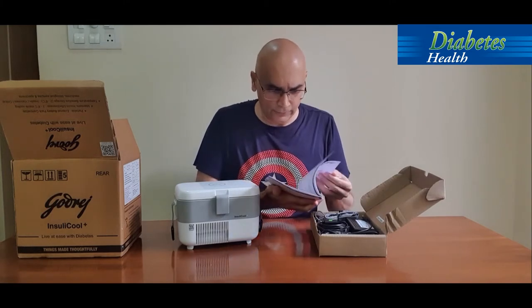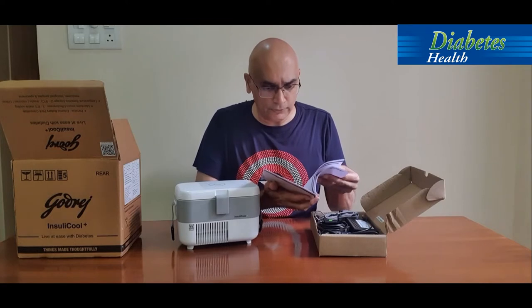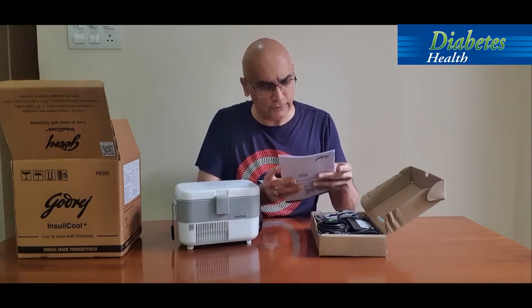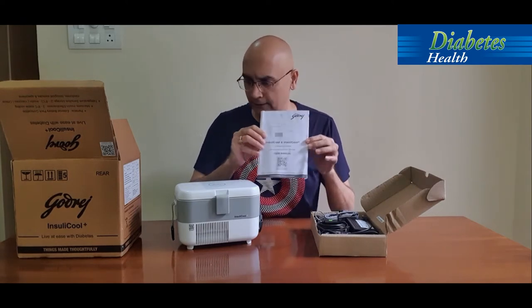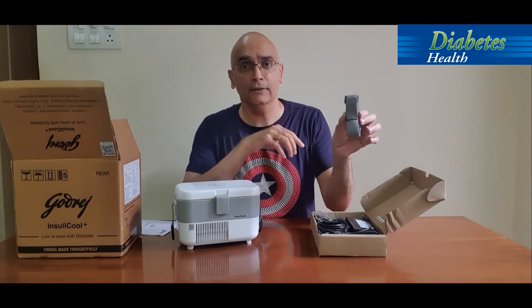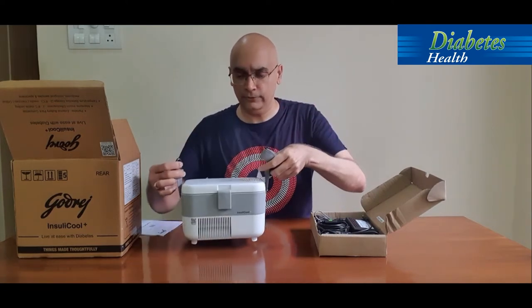Inside we have a nice instruction manual that tells you everything about how to install it — it's very easy to install — along with usage instructions, frequently asked questions, and troubleshooting tips. This simple manual should be enough to get started. There's also a shoulder belt provided which you can strap on your shoulder; it's so light you can carry it comfortably.